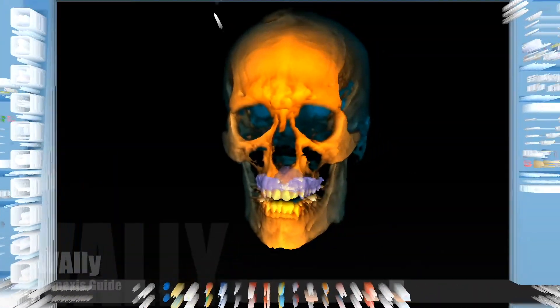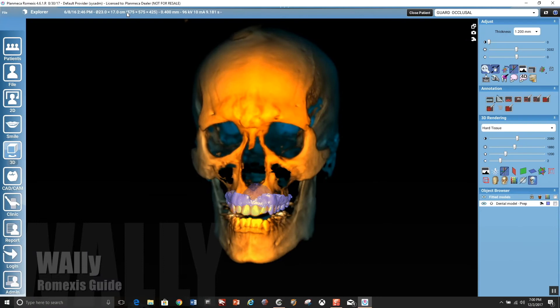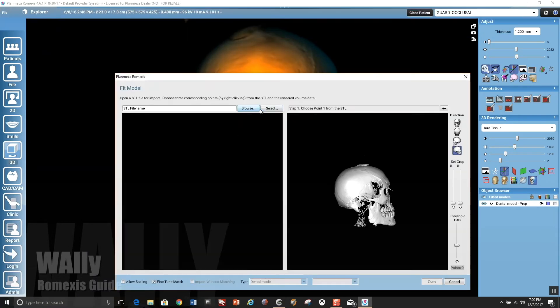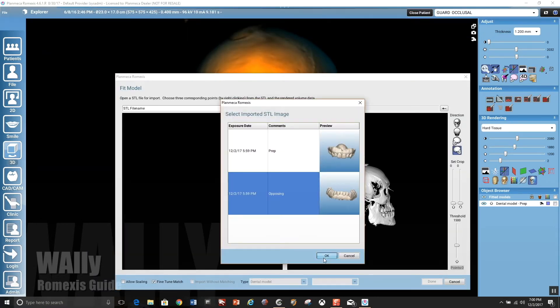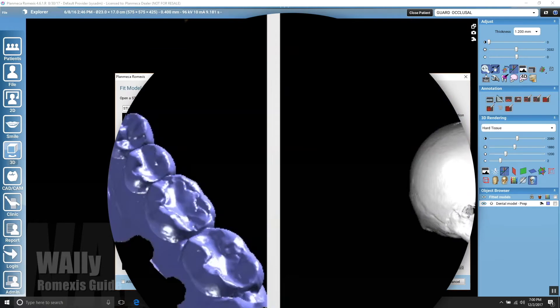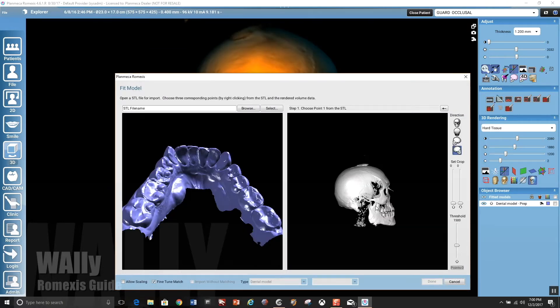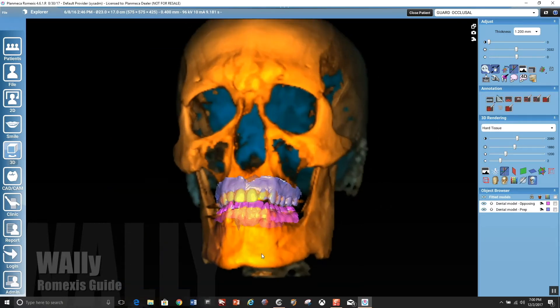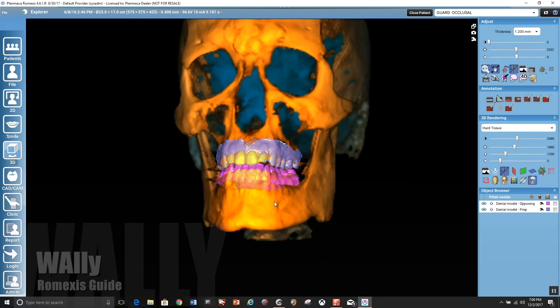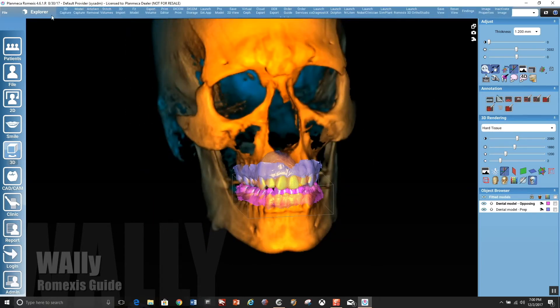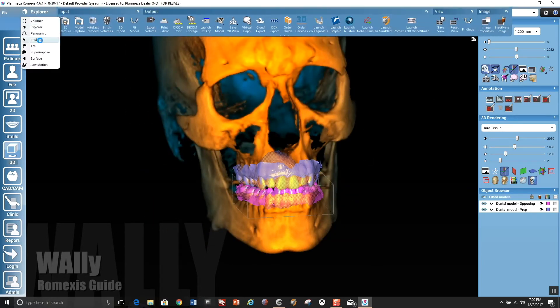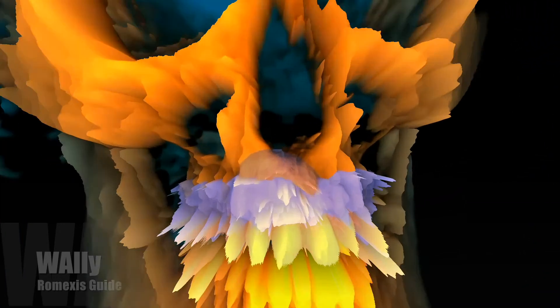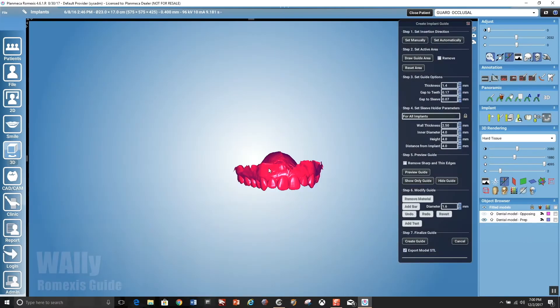And here we could see that the STL file from an intraoral scan has been imported. Now we're going to load the mandibular using existing match from the emerald scanner. And this was taken in centric relation in a slightly open bite. And you notice that it's just importing it in at that capped orientation.